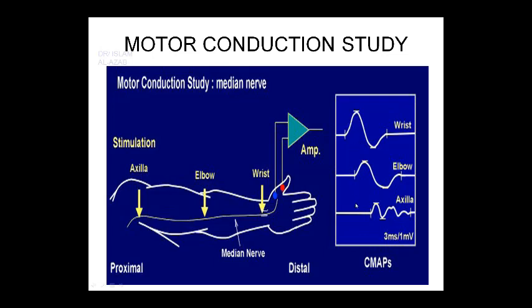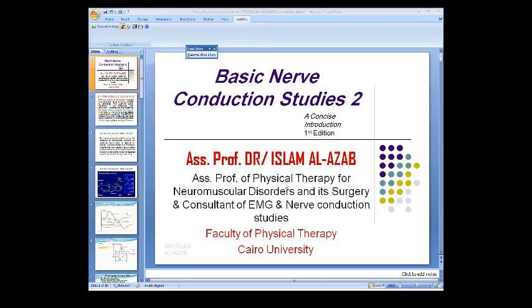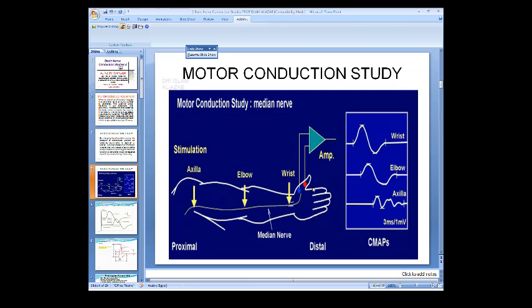The difference between the three sites, as we see, there is a clear difference in the latency between the three sites.